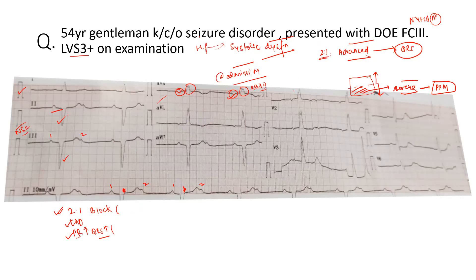If you see the ST-T changes — there is an R wave, there is an S wave, and an R prime wave. Whenever we have an RSR', it usually means right bundle branch block. But for calling it an RBBB, there should additionally be a wide S wave in lead one, AVL, or V6. Is it there? There is no S wave in lead one, no S wave in AVL, no S wave in V6 — or it's a small S wave that doesn't look like a true RBBB S wave. So can we still call it RBBB?